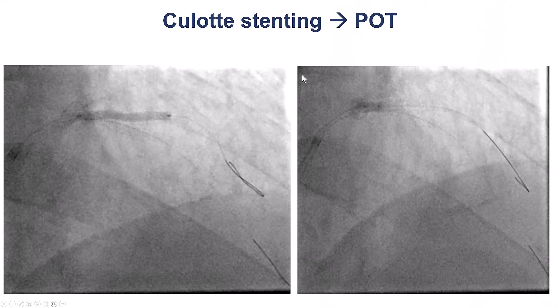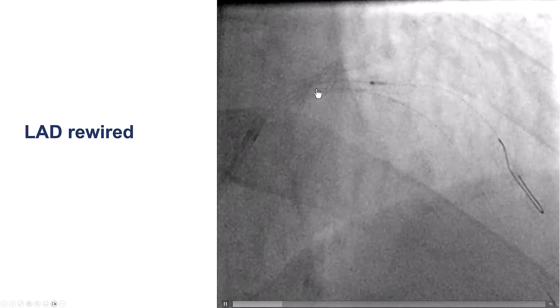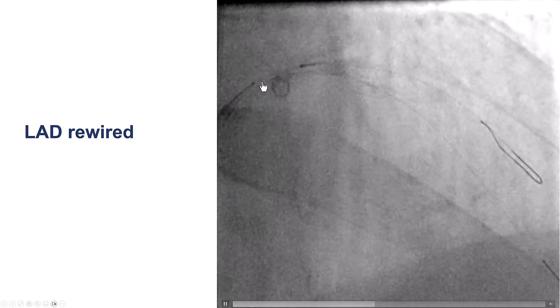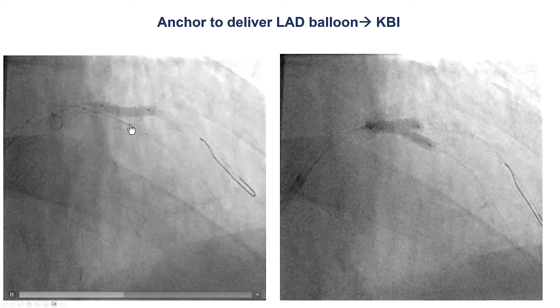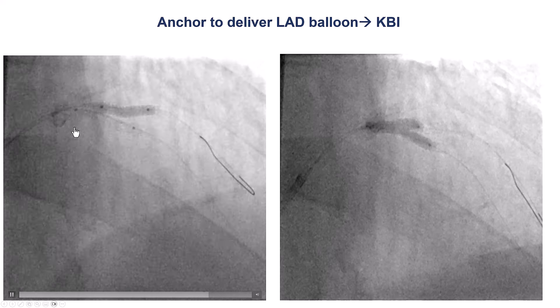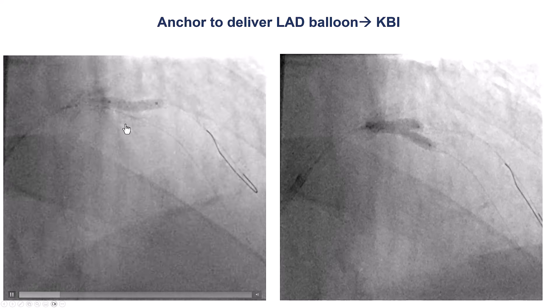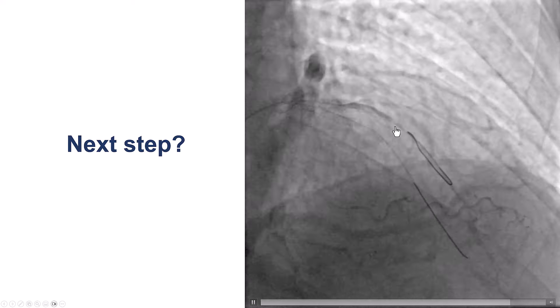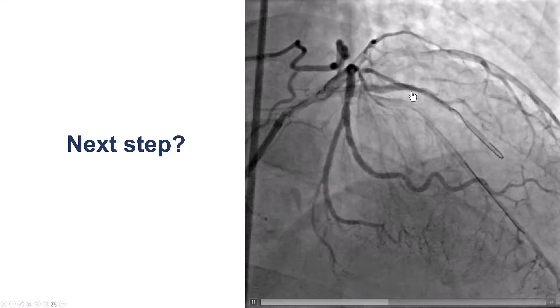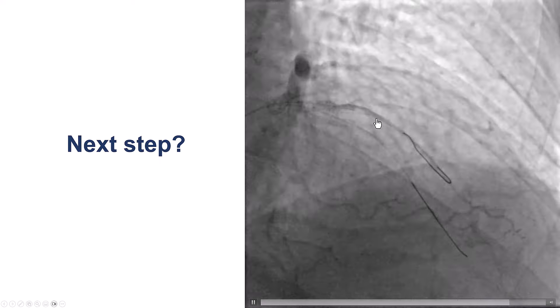So what should we do next? We thought that the issue was probably some dissection of the diagonal origin, and that's why we decided to convert to two-stent stenting using the culotte technique. We did proximal optimization, then extended across the LAD into the diagonal branch, and used the Sasuke to advance a workhorse wire into the LAD. We had difficulty getting the balloon in the LAD but did the side branch anchor — the side branch balloon inflated in the diagonal — which helped the LAD balloon come through, allowing kissing balloon inflation. To our surprise, we still had the same issue: flow in the diagonal branch remained very poor.